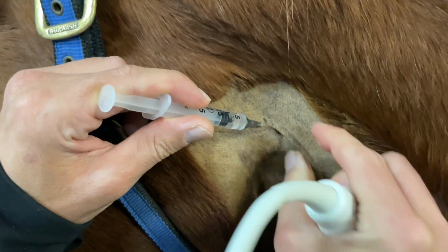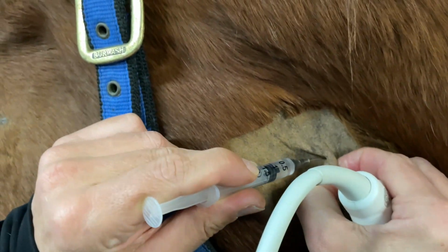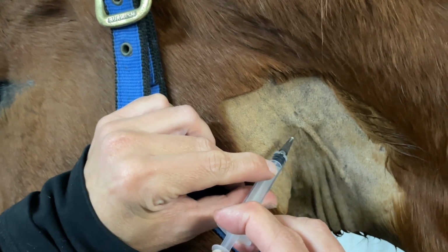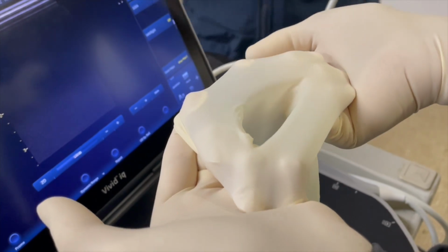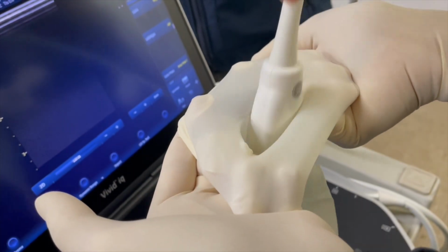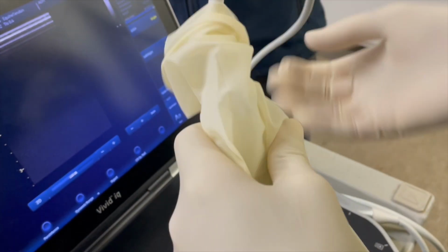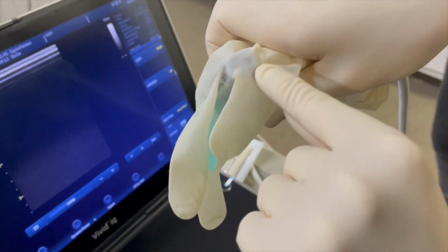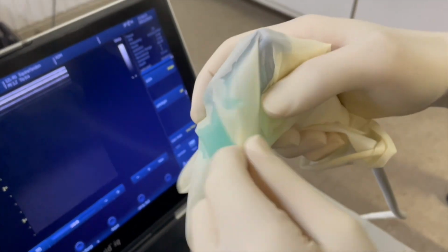Clean the skin with alcohol and inject 1.5 milliliters of lidocaine subcutaneously using the 25 gauge needle. Then perform your aseptic prep. If using a sterile glove, fill the glove with gel, insert the probe, and remove any air bubbles. Be sure to note the ultrasound marker before sealing the glove tightly around the probe.